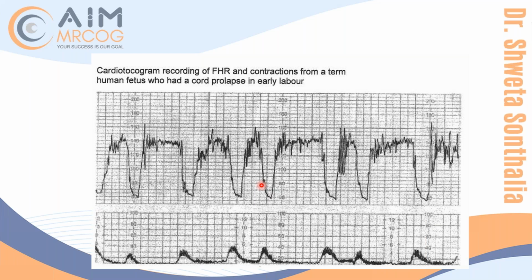I know it is difficult, and believe me, I totally agree with you all, and even I face the same thing. But once you know more and try to fix yourself like that, it's easier. If you want to make it a late deceleration of 60 beats, it's quite detrimental, believe me. You will not get any variability. As I told you, late deceleration always comes with decreased variability. At the baseline, the variability looks all right, but here, no variability.